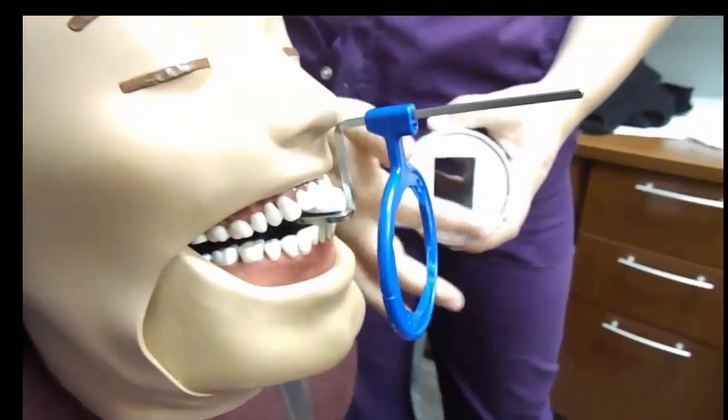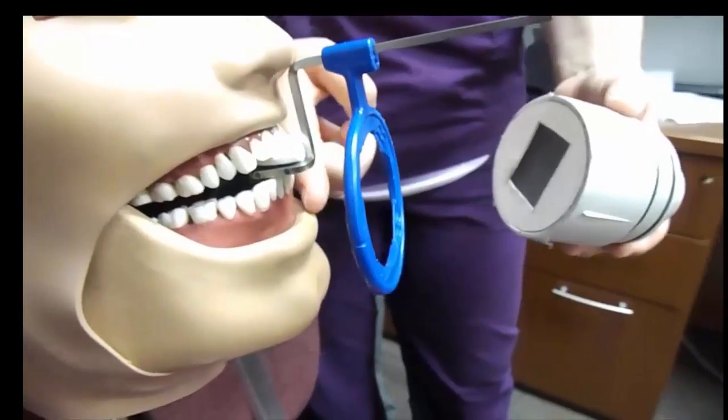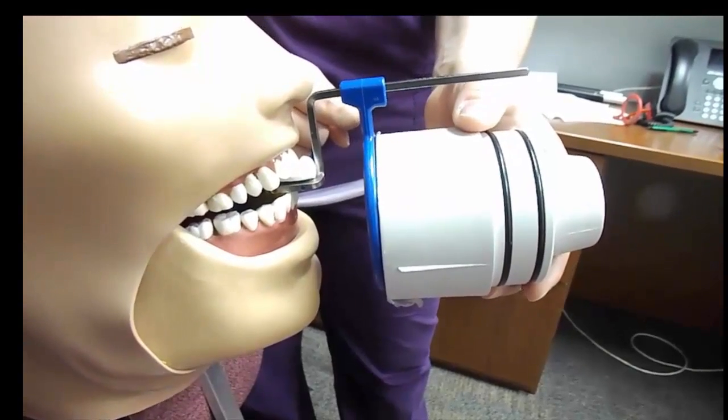Slide your ring in about an inch from the patient's face. Look at the end of your tube at the collimator to align your cone or your square with the orientation of the phosphor plate. Have the tube nice and flush and align your notches.